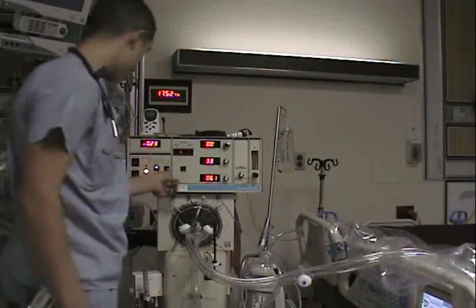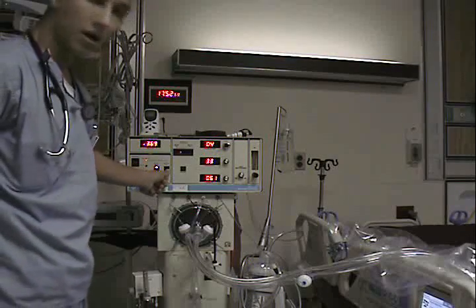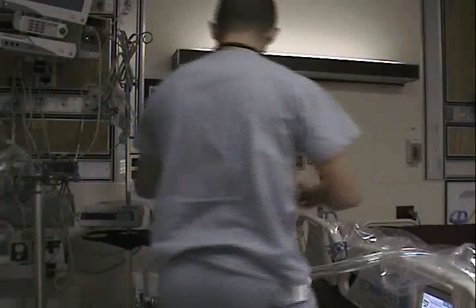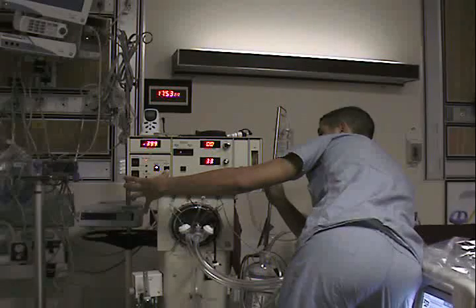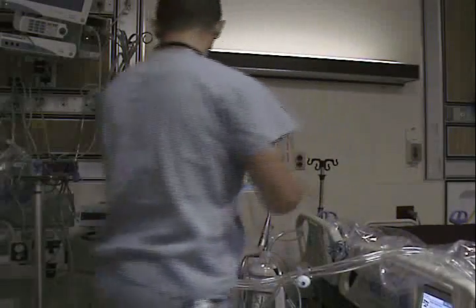Press and hold reset. What this is going to do is fill your circuit with mean airway pressure. Now observe the mean airway pressure on the display and adjust the patient calibration screw, which is over here, to a reading between 39 to 43 centimeters of water pressure.